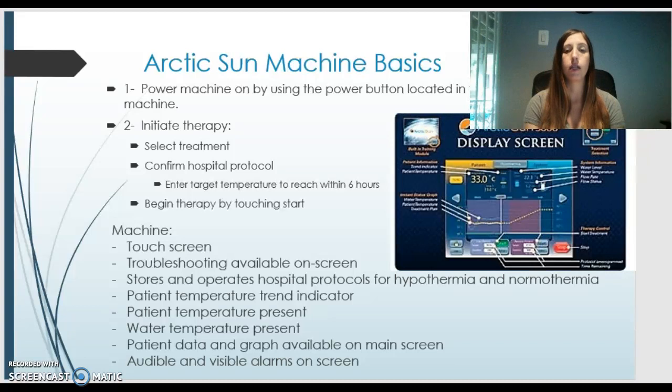You confirm the hospital protocol either by entering the target temperature to reach within 6 hours, or by confirming the pre-programmed protocol that should match your hospital protocol. And then you want to begin therapy by touching the start button. It's a green rectangular button that says start.